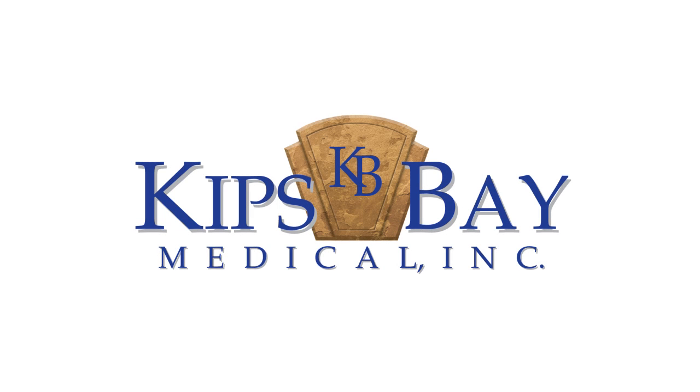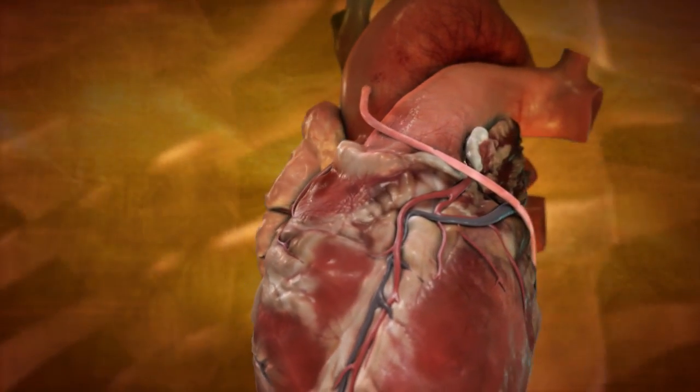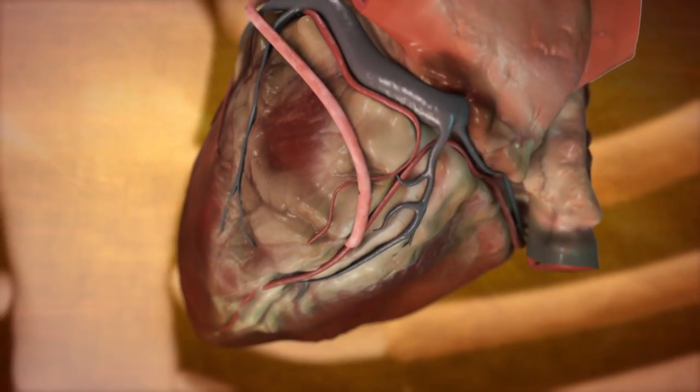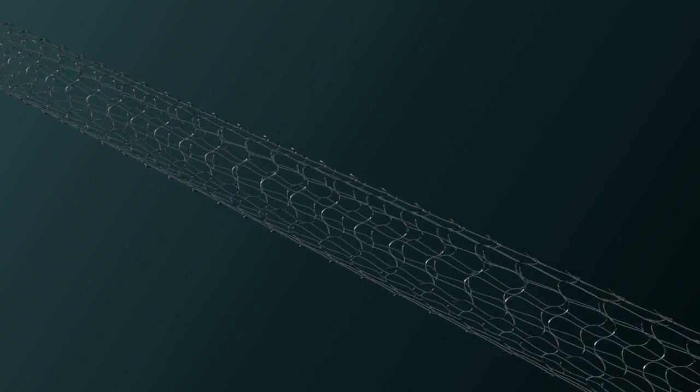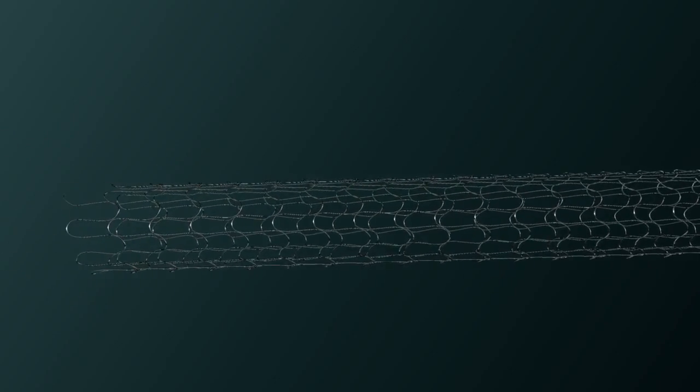Kips Bay Medical, a medical technology company dedicated to advancing, refining, and improving cardiac surgery. Contemporary CABG or coronary artery bypass grafting typically includes the use of saphenous vein conduits to bypass multiple coronary vessels. Introducing the Kips Bay ESVS mesh, a single strand knitted nitinol wire prosthesis indicated for maintaining saphenous vein graft patency in patients undergoing coronary artery bypass surgery. The ESVS mesh, placed over the outside of the vein graft, is designed to mildly downsize vessel diameter and provide a compliant external support to the vein wall.